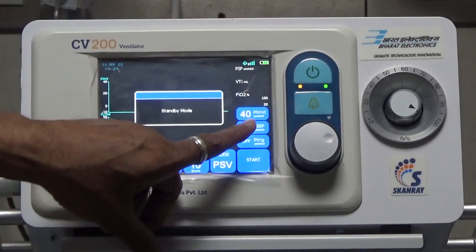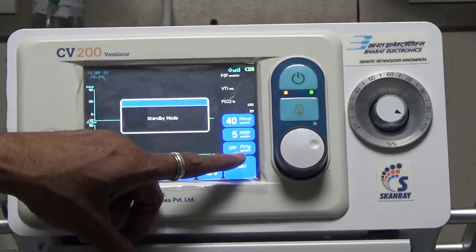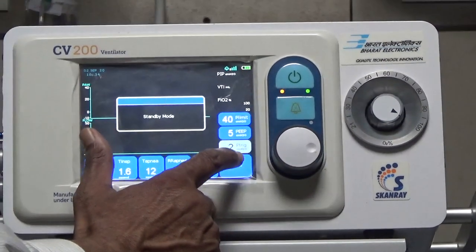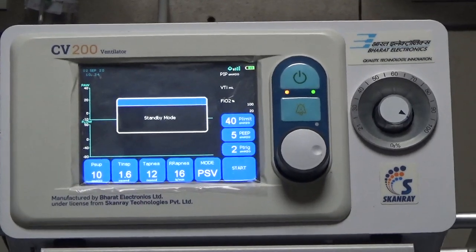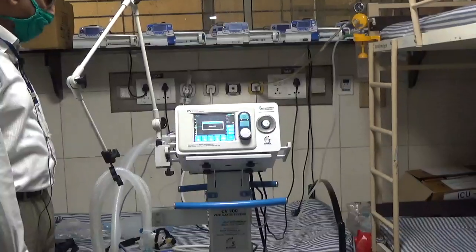And then you can see that you can make a PEEP setting, you can have a pressure limit setting, and you can set the trigger. So the trigger is generally set at 1 or 2 so as to make it very easy for the patient to trigger the ventilator. Now, before I demonstrate how the machine is to be attached, let me tell you about the mask.